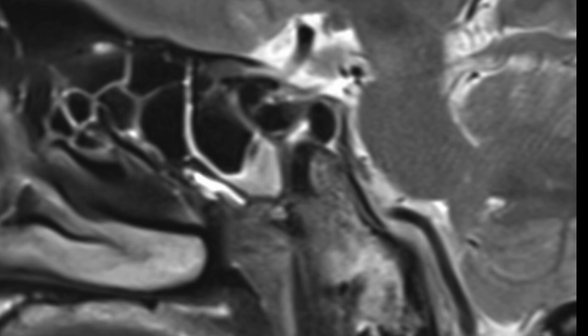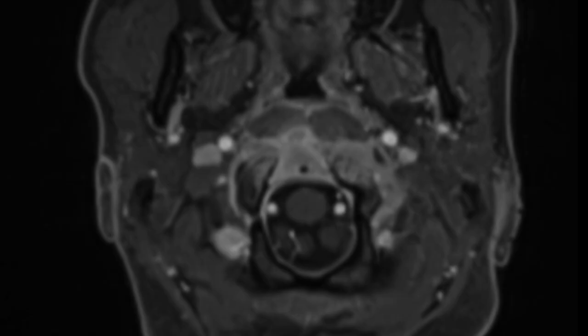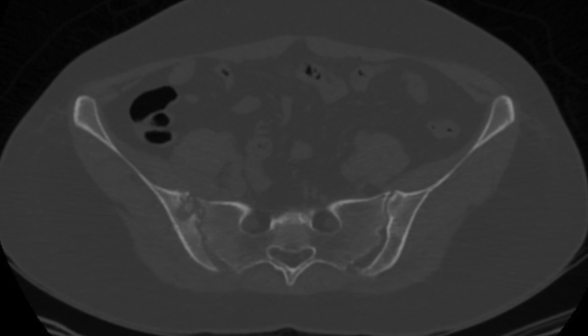Permeative lytic lesions in the base of skull can be seen in osteomyelitis. Similar lesions can also be seen in metastasis. Although not common, similar lesions have been described in eosinophilic granuloma or Langerhans cell histiocytosis as well. Button sequestrum has typically been described in tuberculosis and eosinophilic granuloma or Langerhans cell histiocytosis. Unilateral sacroiliitis involving the right SI joint in this case would typically be seen in infective sacroiliitis.